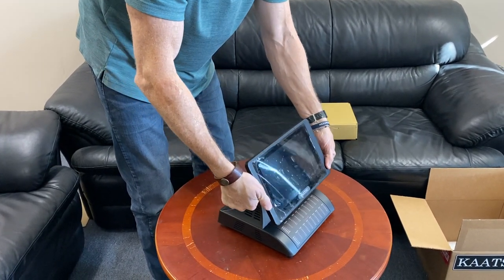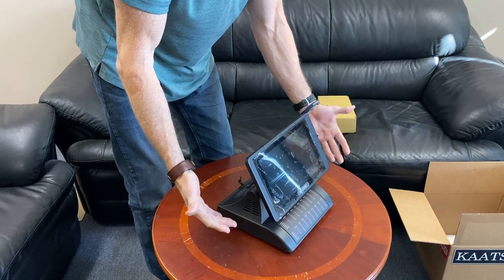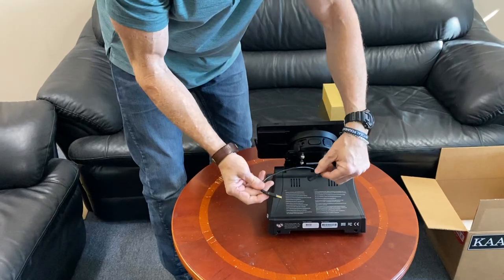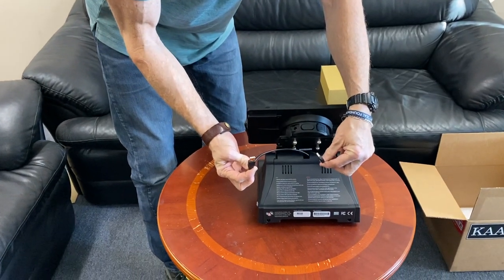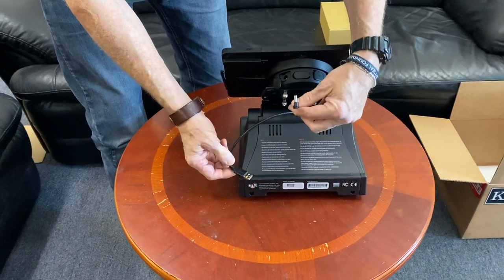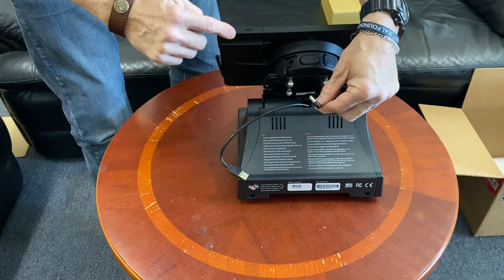You can pivot the tablet like this. In the back, when you receive it, you'll see two disconnected pieces — one is a USB-A and one is a power cord to the tablet.